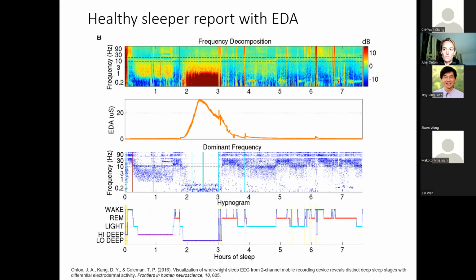So what's the unit of this EDA? It's microsiemens, from the Empatica. Oh, okay. Because this is very interesting. A company in Japan called NeuroCare developed a pillow that forms an electromagnetic field, so that when you are sleeping, it's as if you are in the magnet of the scanner.